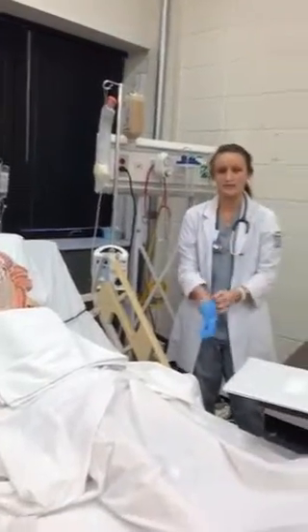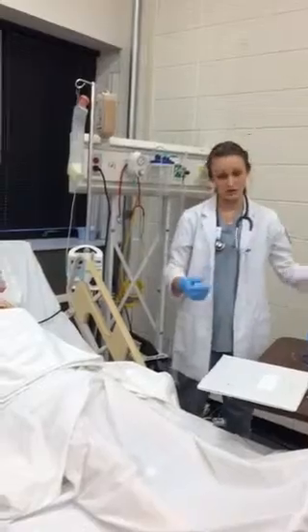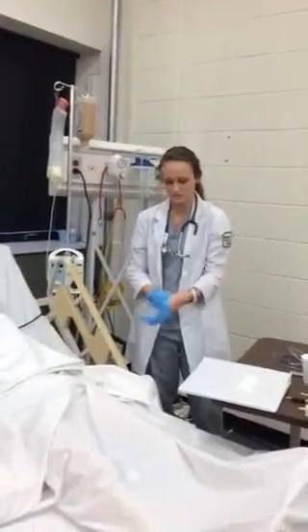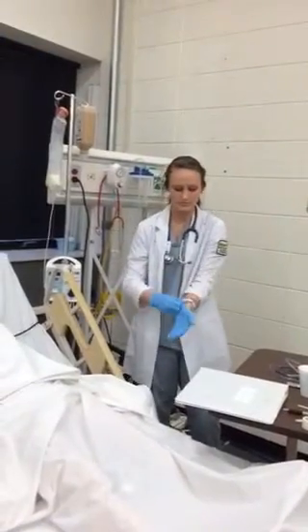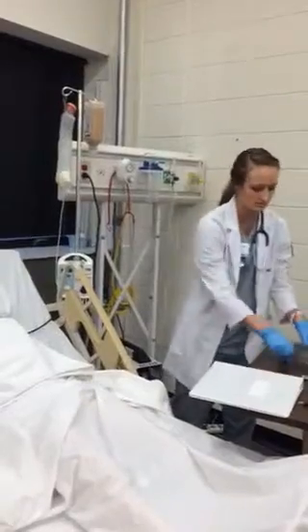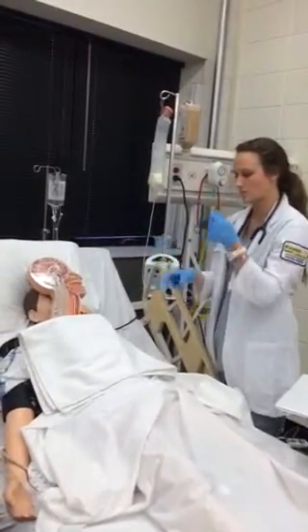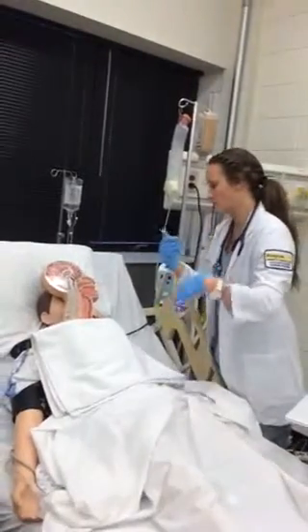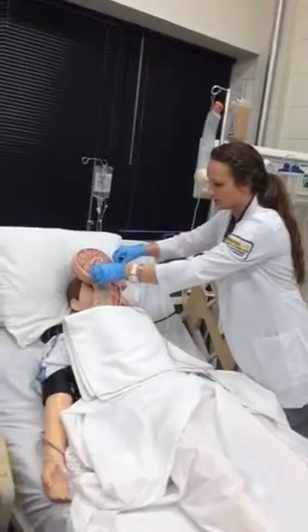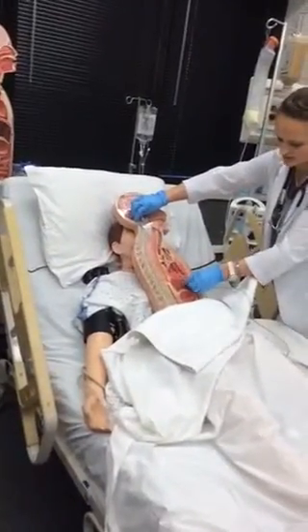And once my gloves are on, I'll go ahead and measure the tube from the tip of the nose to the earlobe and down to the xiphoid process. And I'll mark the tube wherever my measurement is. So you're going to take it from the tip of the nose, earlobe, down toward the xiphoid process.